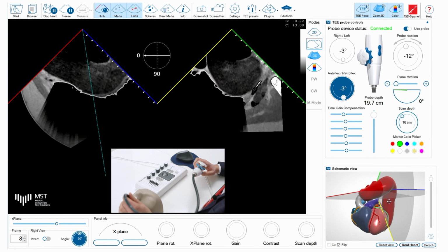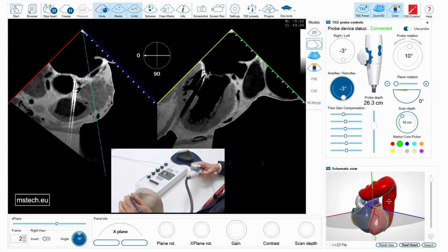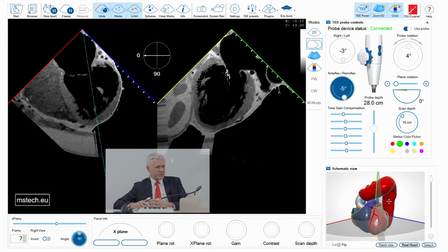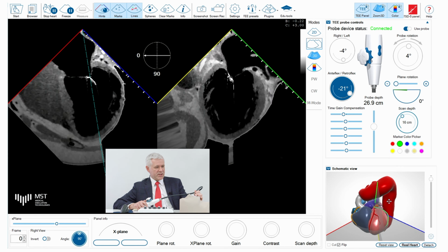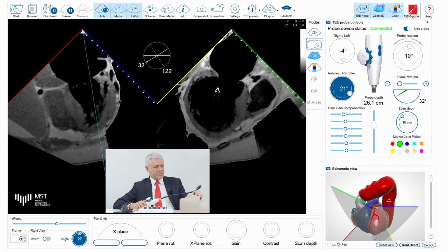Patient underwent surgery. Aortic valve had to be replaced. Unfortunately, myocardial infarction created LV dysfunction, which then caused mitral regurgitation. So that's why the patient had afterwards mitral valve treated with the edge-to-edge technique. And here you see that there is a mitral clip implanted in the mitral valve.